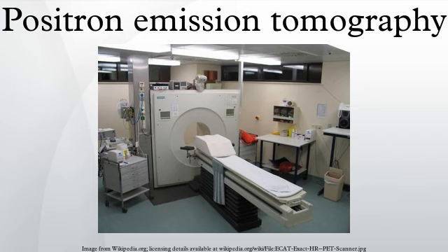The development of a number of novel probes for non-invasive, in vivo PET imaging of neuroaggregates in human brain has brought amyloid imaging to the doorstep of clinical use. The earliest amyloid imaging probes included 2-(1-{6-[(2-[18F]fluoroethyl)(methyl)amino]-2-naphthyl}ethylidene)malononitrile, developed at the University of California, Los Angeles, and N-methyl-[11C]2-(4'-methylaminophenyl)-6-hydroxybenzothiazole, developed at the University of Pittsburgh.